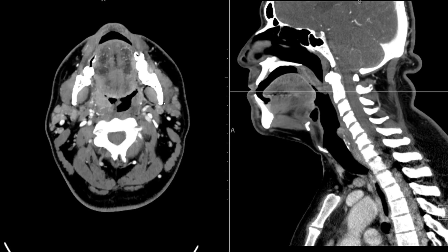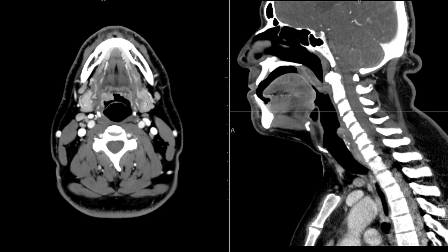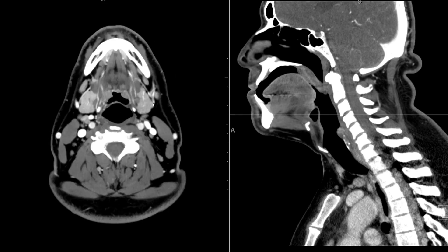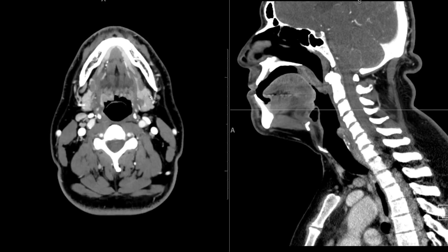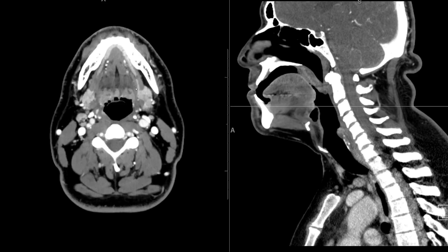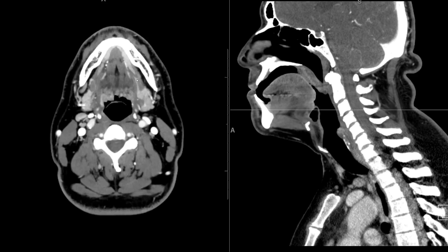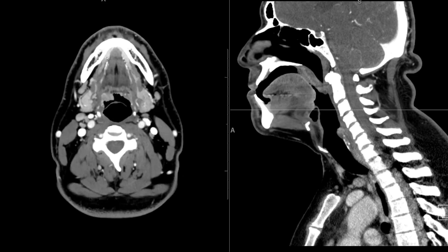Next is the submandibular gland. Here is the mandible, so the submandibular gland should be below it — here are the left and right submandibular glands. You can see its extent as it extends behind the mylohyoid muscle into the floor of the mouth along the expected course of the duct, which empties on the floor of the mouth. We can also see the sublingual glands here, very well enhancing, the left and right sublingual glands.